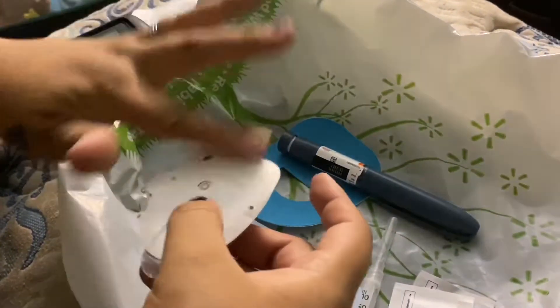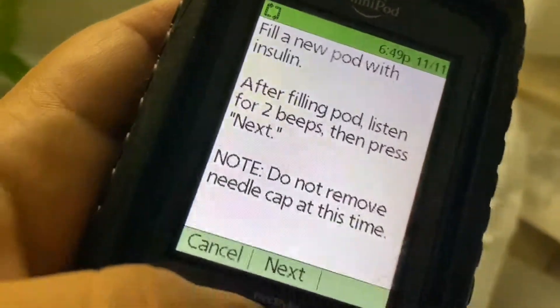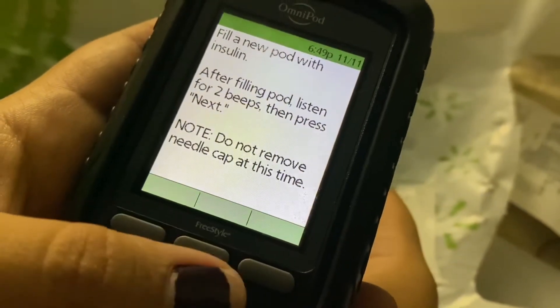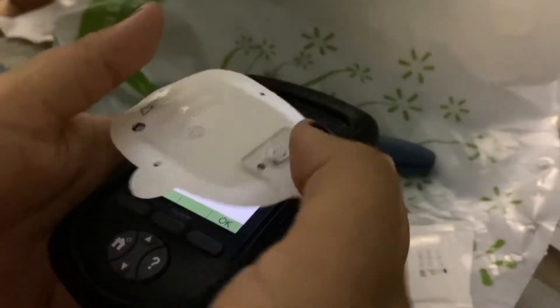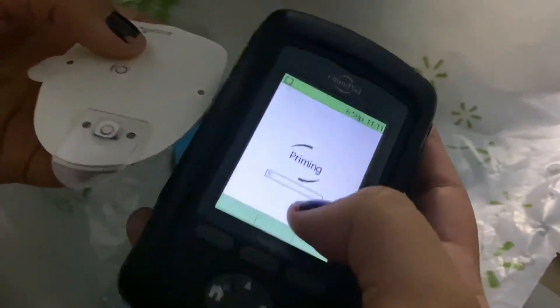On here we are going to press next, move the PDM close — and that is literally what I do until it gets going. Now it says okay, and now it is priming.